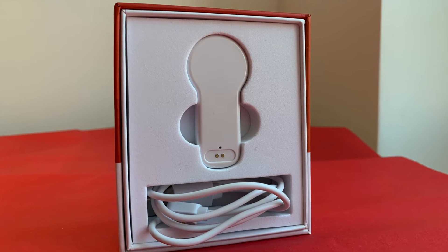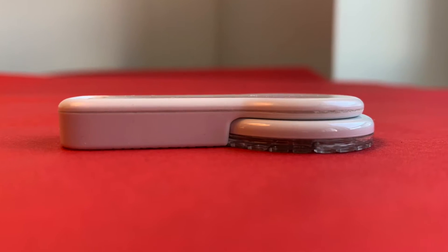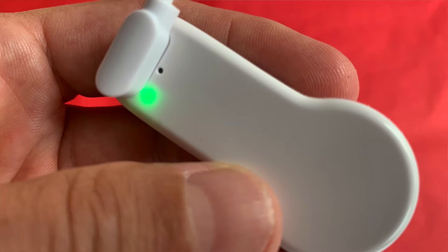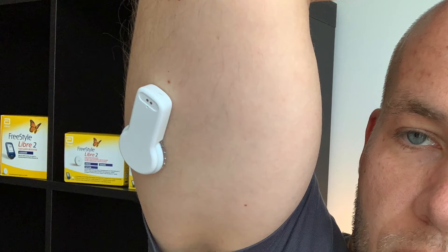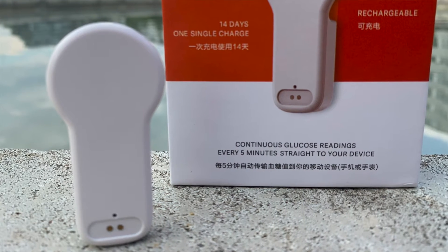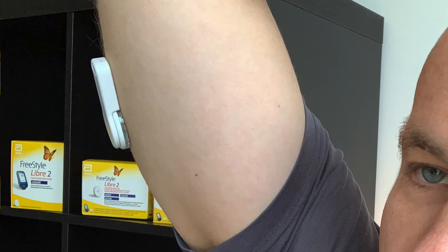Meow Meow 2 works with all types of Freestyle Libre sensors and uses an app called Tomato. The biggest difference between the first and second generation is in design. Meow Meow 2 is smaller, slimmer, a little bit lighter, and should provide more reliable connection to your sensor and your phone. It looks like a tiny spoon and has a bigger contact area with the sensor so the transmitter stays in place much better. The color is something between white and soft gray, matte, which actually looks pretty cool and very modern. Meow Meow 2 weighs only 6 grams, which is 2 grams less than the first generation.